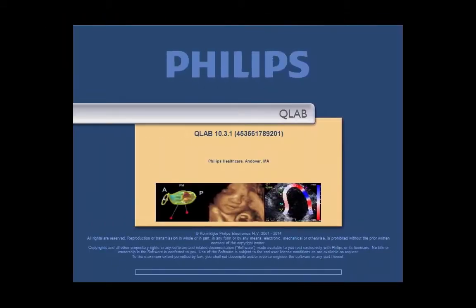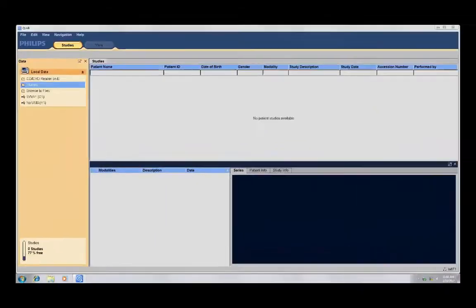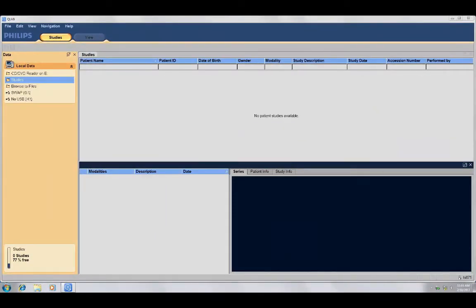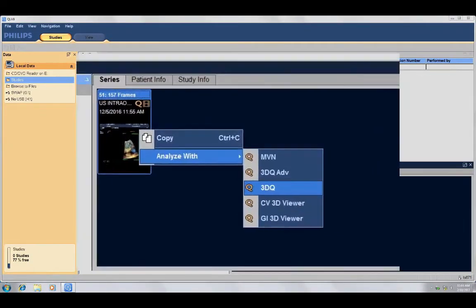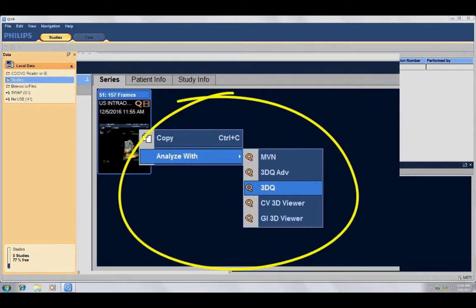Once the data is exported, open up QLab, then open up your patient's file that you have just exported. Right-click the image and under Analyze With, select 3DQ.